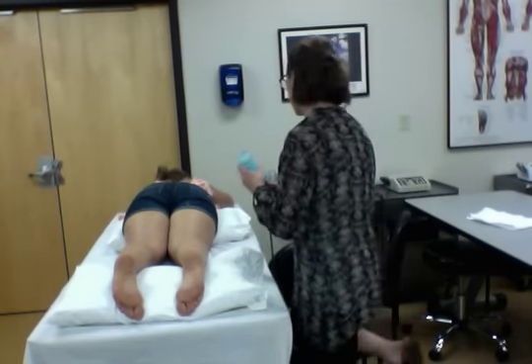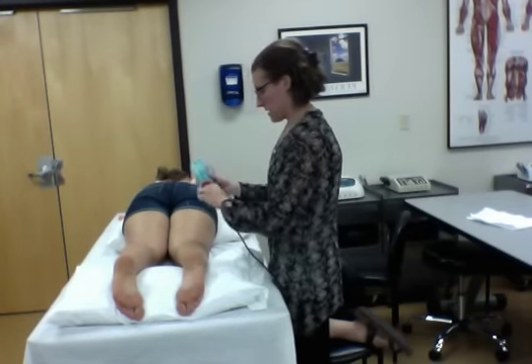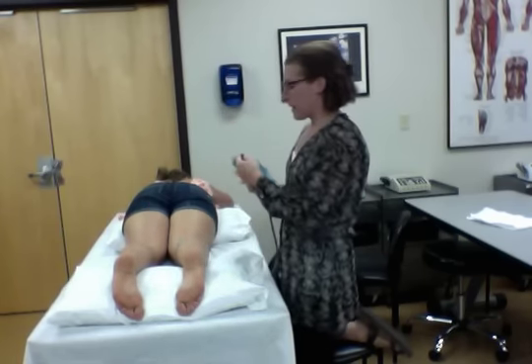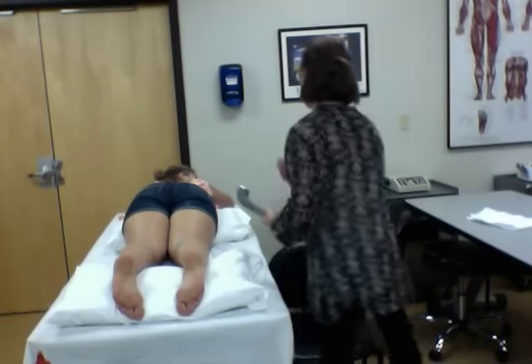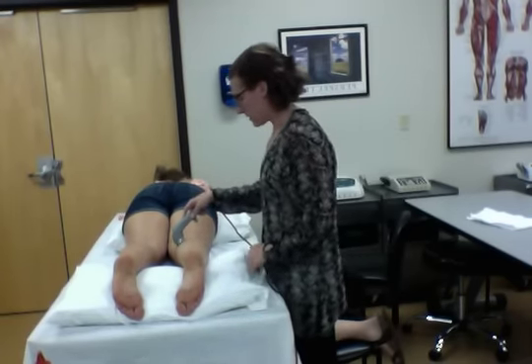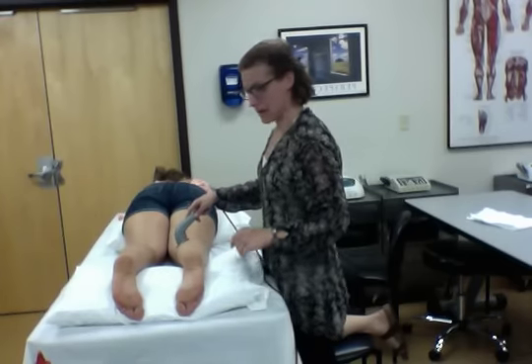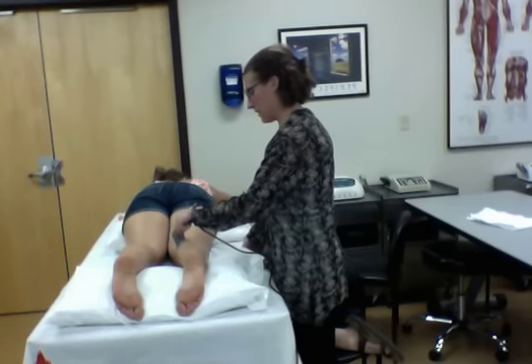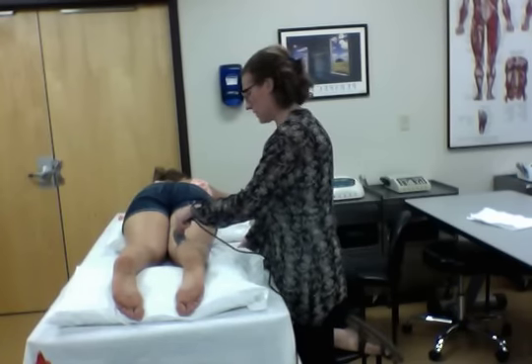And JC, I'm just going to put some gel on the back of your leg right where it hurts. So it just feels cold. And this really shouldn't feel like anything other than me moving the gel around on your leg. So if you feel any warmth or discomfort at all, just let me know. Okay? Go ahead and get my ultrasound head moving and press start. Make sure the timer's actually counting down. And then perched here comfortably where I could stand here for 10 minutes and do this.